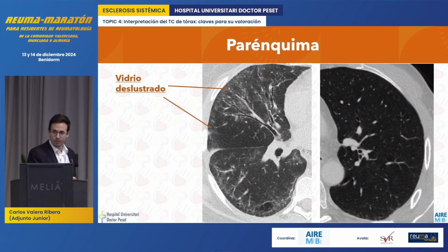So the first lesion is like in dermatology, elementary lesions. Ground glass, this image is like glass. I like the phrase I heard at the ACR. It's like the windshield of a car in the morning. You can see through it. You can see the structures, the vessels. The bronchi are dilated, but you're seeing it as if it were, right? White and hazy.